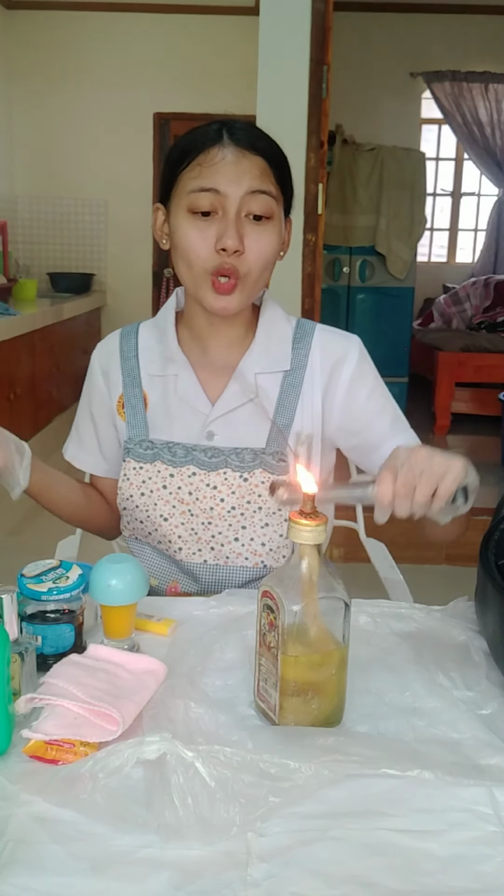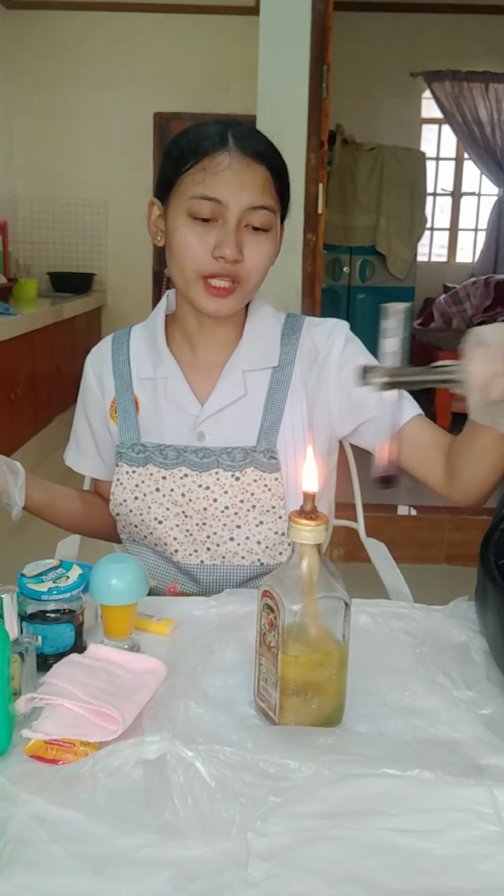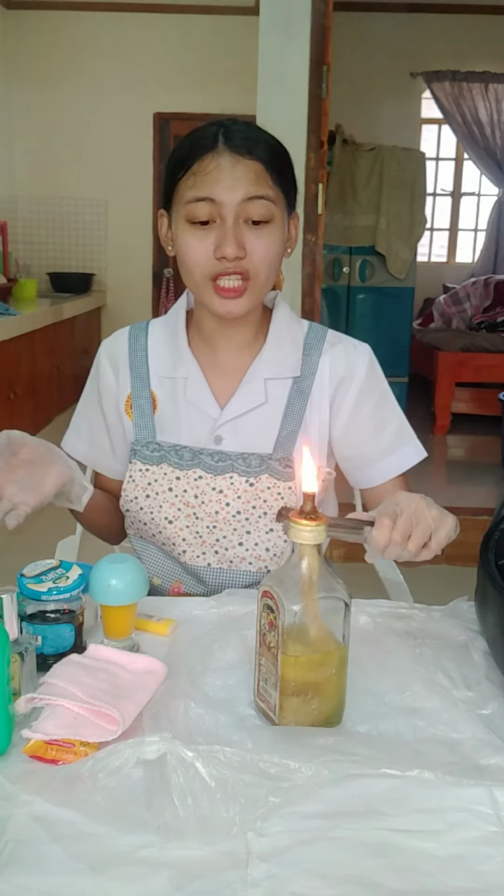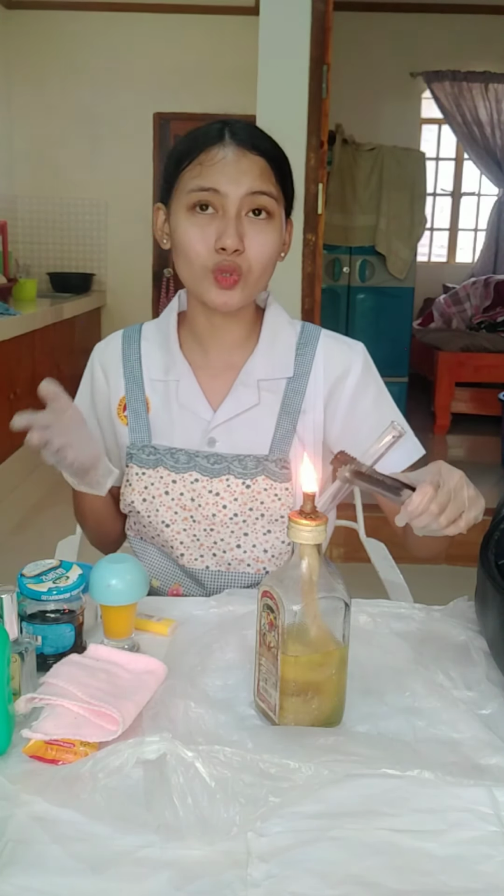And then after that, we need to hold the test tube and pass it over the flame. And then after that, we need to boil it for about 2 minutes and let it stand for 1 minute. And then after that, we need to put the flame out. And then we need to observe for changes in color. So if there is no change, it is a clean blue, negative.